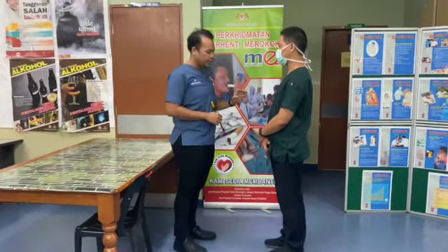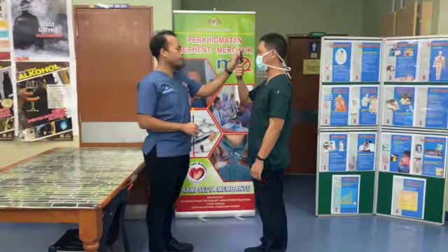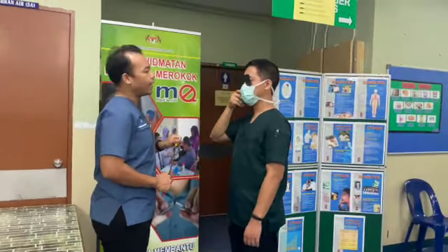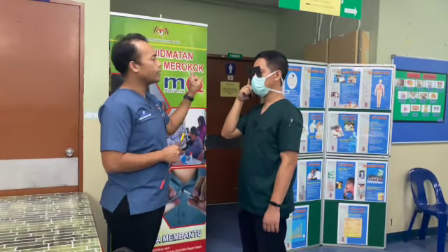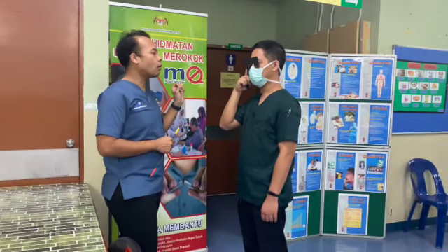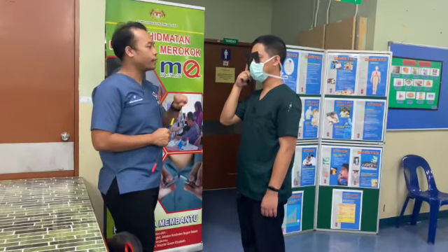The procedure is like this. Just close the eye using the pinhole, use one hole, and then we show the patient fingers, 1, 2, or 3.